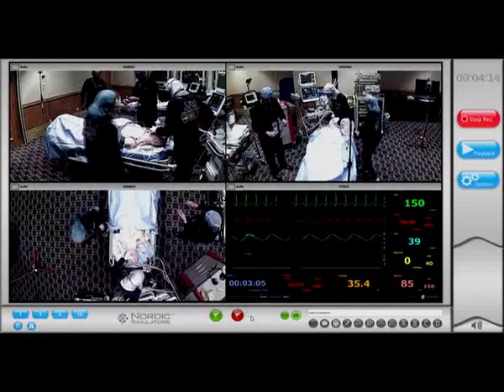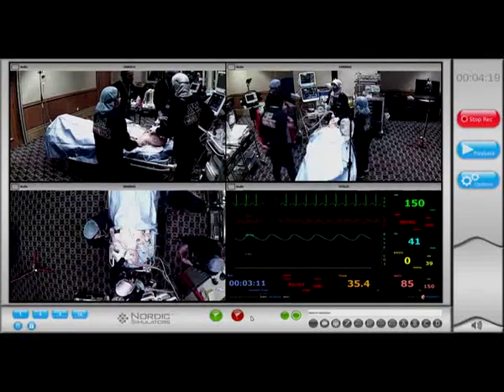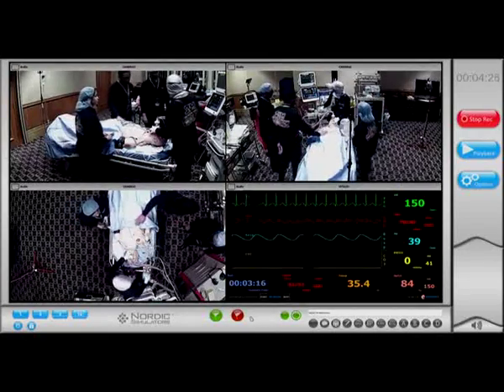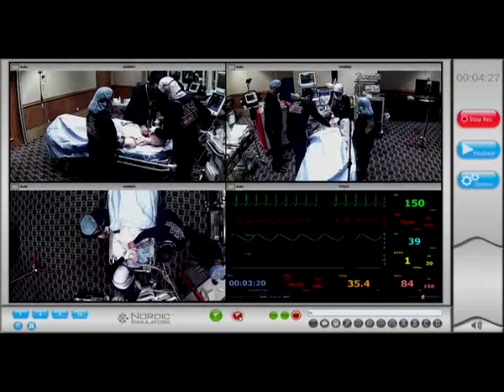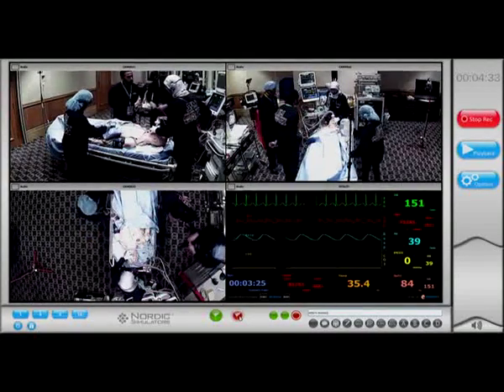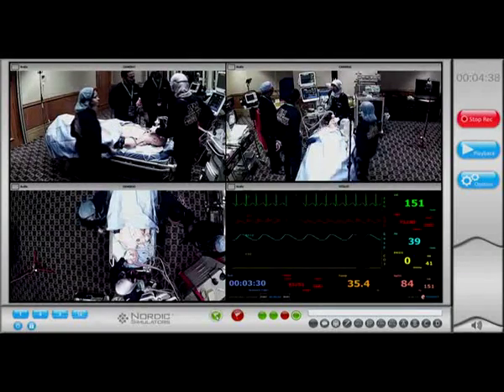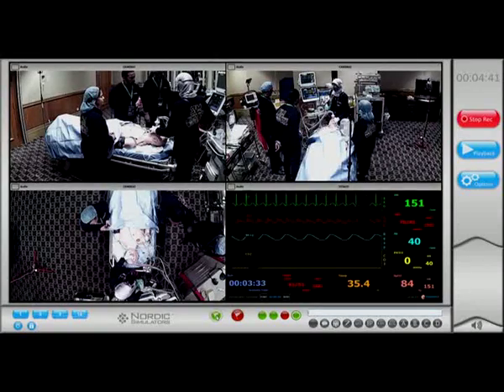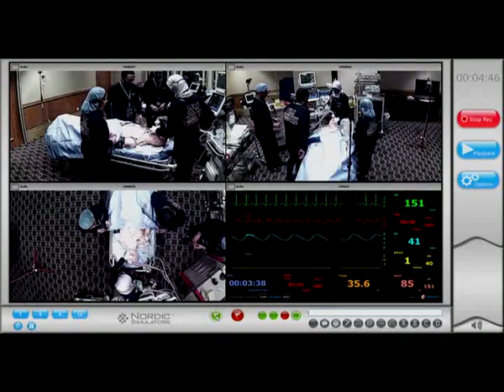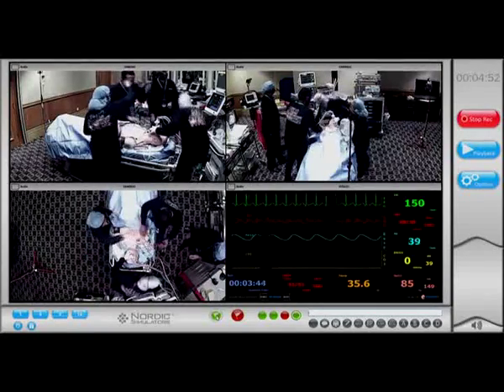Hi, Abrar. Tell me what happened. This is a 20-year-old male patient who arrived as a case of an RTA. He was complaining of shortness of breath, but there is no pulse in the vitals. Could you please check? There is a pulse, it's possible. Can you connect the saturation monitor again? He was confused, complaining of shortness of breath. I noticed that he was cyanosed, so I kept him on a simple face mask. So you have shortness of breath, hypotension along with tachycardia. Was the air entry bilateral? Can I have a stethoscope, please? Recheck it. Air entry was fine. Is he responsive? Now he is unresponsive.